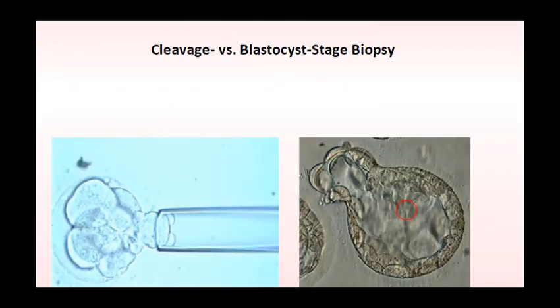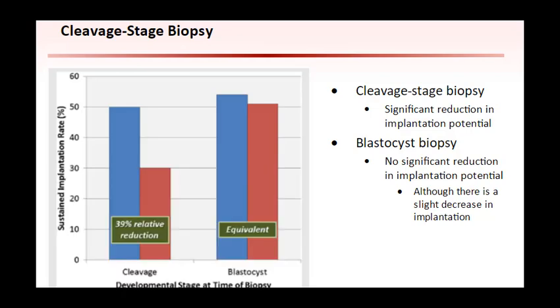To follow is a discussion of the differences between cleavage and blastocyst-stage biopsy. In a randomized controlled trial by Scott and colleagues, one group had embryos transferred at the cleavage stage and the other at the blastocyst stage. One embryo for each patient was biopsied, while the other was not biopsied. Embryos were tracked by DNA if a live birth resulted to determine which embryos implanted.